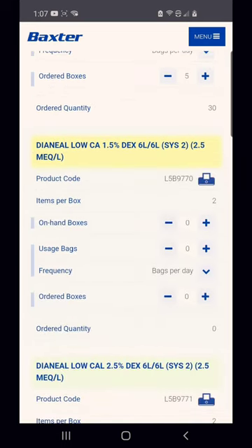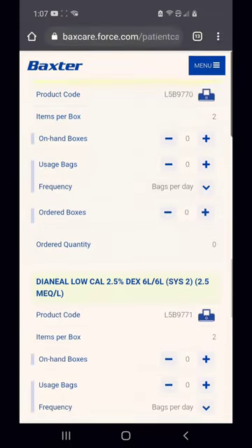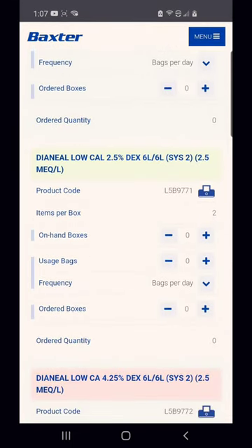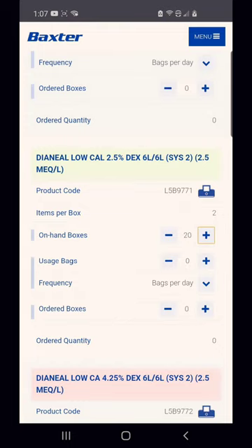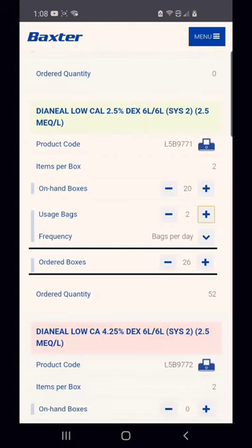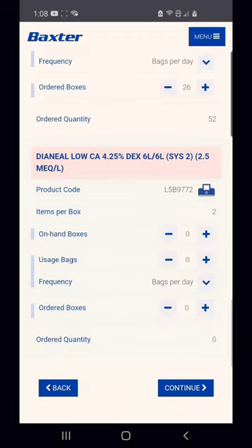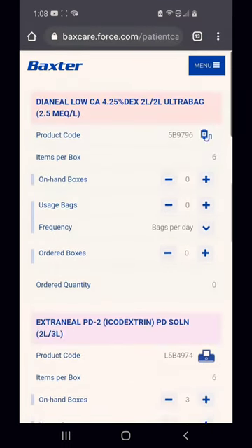I don't use yellow. I do use green, 2.5% instead of 1.5%. And I have 20 on-hand boxes actually, and I use 2 bags a night, so I'm going to get 26 boxes. I don't use the red boxes, but again, if you need these boxes for any reason, just add. I don't need any of these.